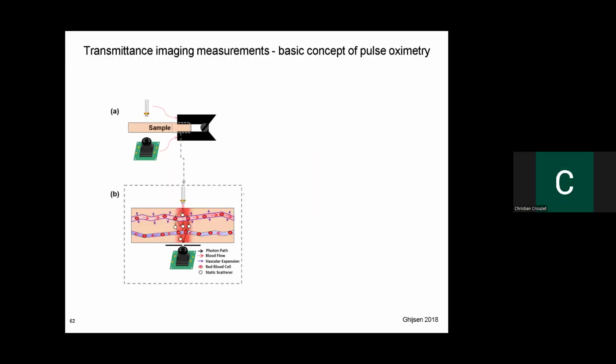So those two examples were in a non-contact format. Now I'm going to go even smaller in terms of the LSI devices. I mentioned pulse oximetry. Everyone probably knows a pulse oximeter clips onto your finger. Well, we wanted to drive towards a finger clip based device. This device was created by previous grad students and postdocs in the lab. They had a spin-off company with this FDA cleared device called the FlowMet.